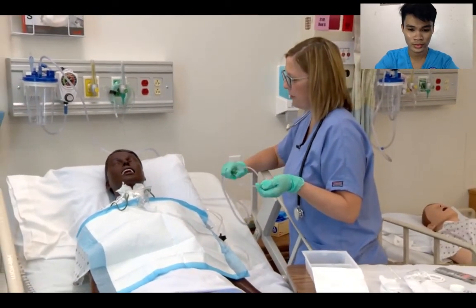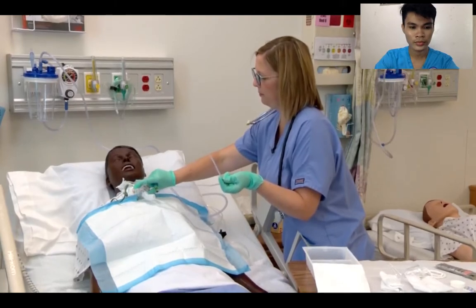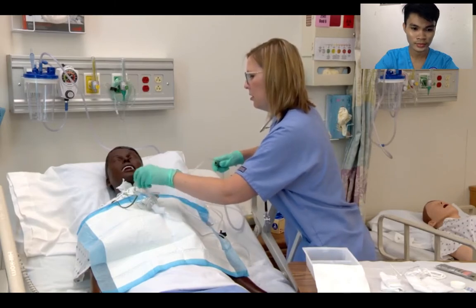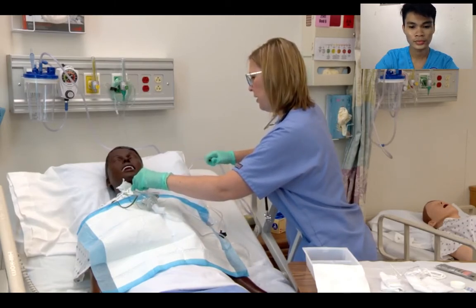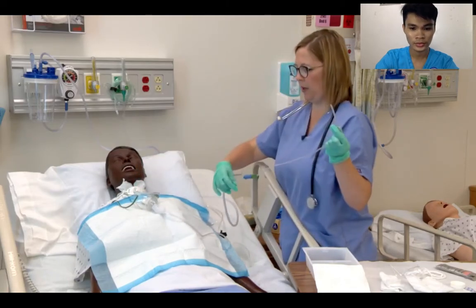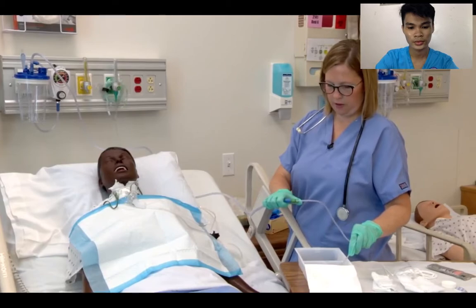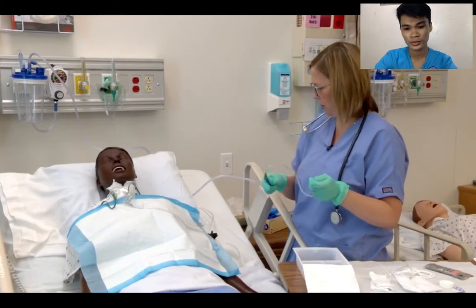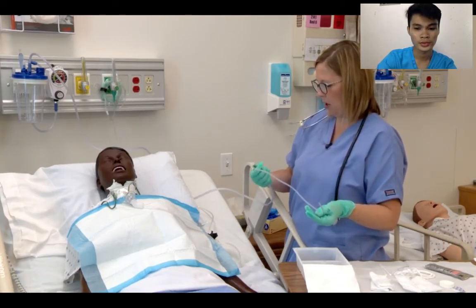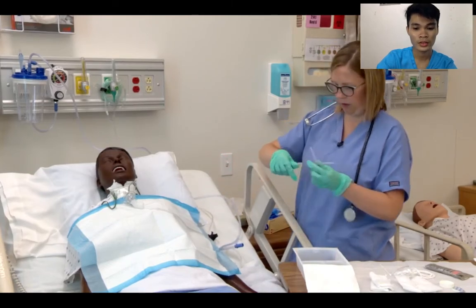Okay, Mr. Jones, it sounds like we've got a little bit of secretion still in there, so we're going to suction again. Take some deep breaths for me. Okay, good. Alright, here we go. Feel a little bit of resistance, then suction. Okay, reapply the oxygen. Clear our catheter. Okay, and we always want to be assessing what our secretions look like, the thickness and the color. Now I can go ahead and separate my two suction devices.